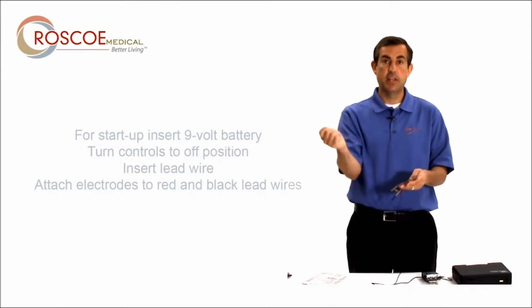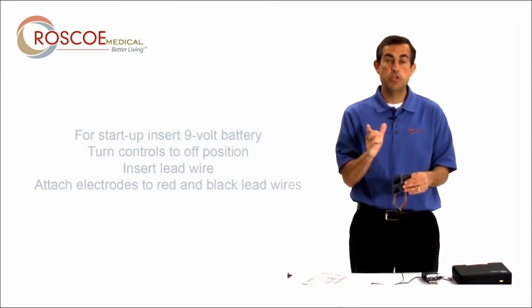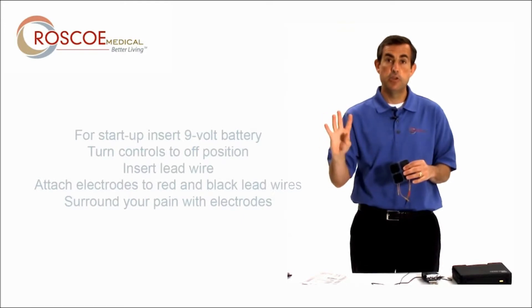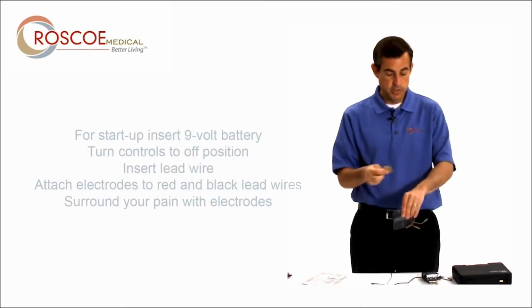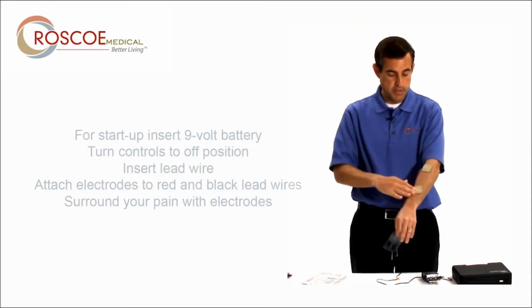Next, take the electrode off its plastic backing and place it where it hurts. It's important to remember that you want to surround the pain. If it's a large area, use four electrodes and surround it. If it's a small area, use two and try to surround it. Today I'm going to say the pain is right in the middle of my forearm.